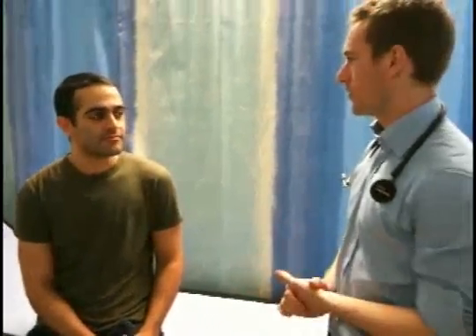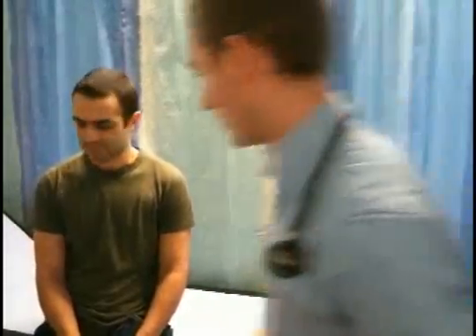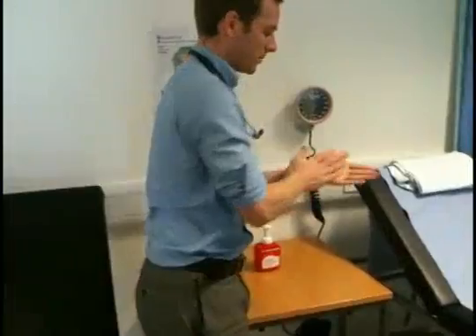My name is Ketan Hodges, I'm a third year medical student. I've been asked to perform a respiratory exam — basically, this is having a listen to your lungs. I'll be using my stethoscope and tapping across your chest. You'll need to be exposed from the chest up, lying on the couch. Would that be okay? I'll allow you to get changed and position yourself. I'll put this couch at 45 degrees and wash my hands and stethoscope.